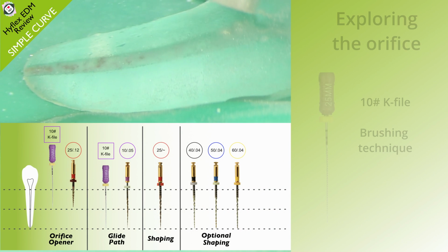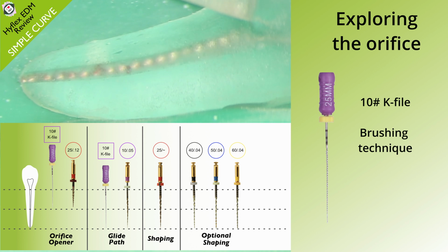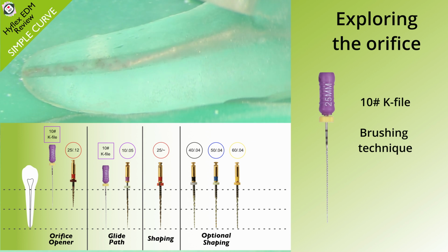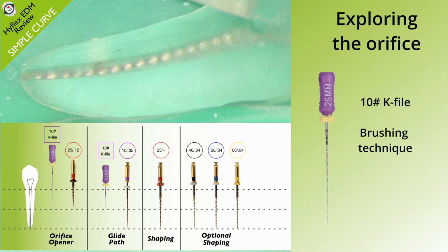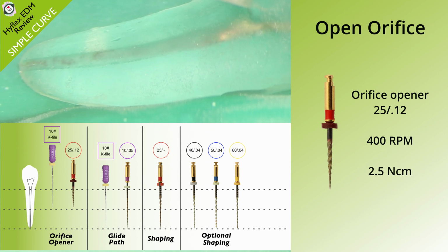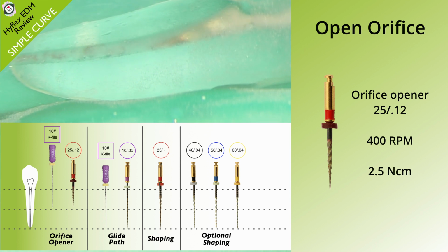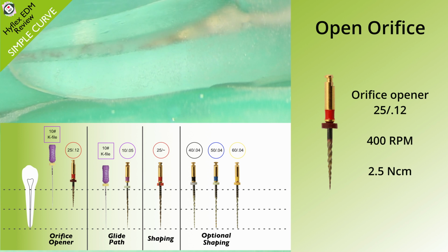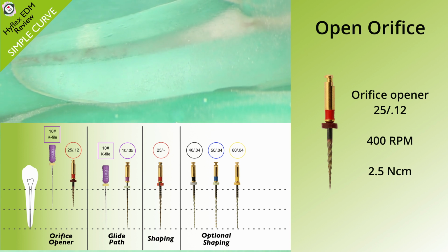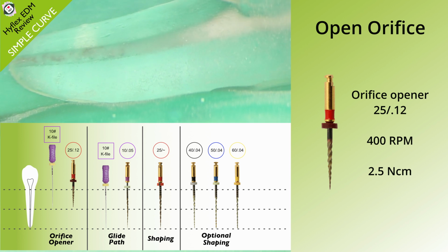So the first live demonstration, we're just going to use it on really simple anatomy, nice straight curve, and we are just exploring the orifice and maybe a little bit of the canal space with a size 10K file, depending on how much resistance we get. I'm then going to use the dedicated orifice opener to open up the orifice, reposition the orifice within the pulp chamber, making it easier for me to place my files and also use lots of irrigation.